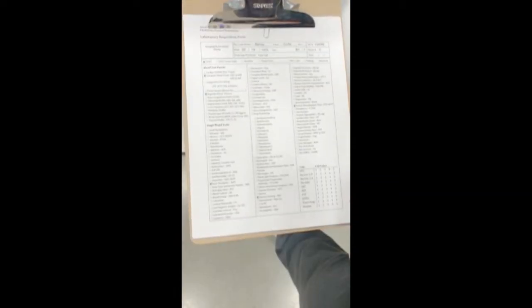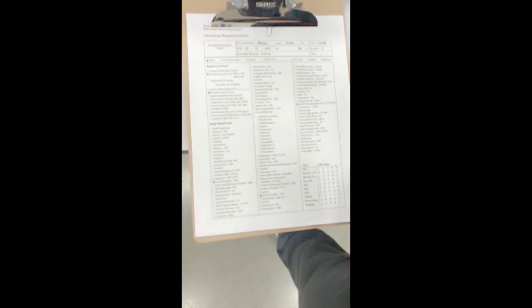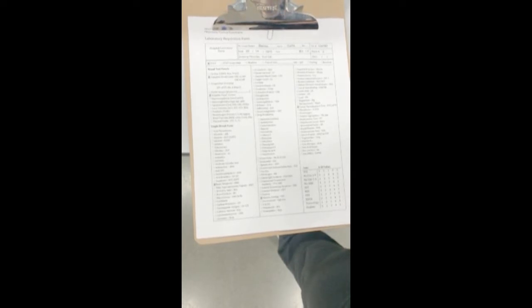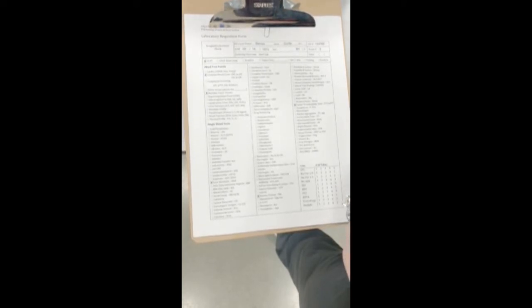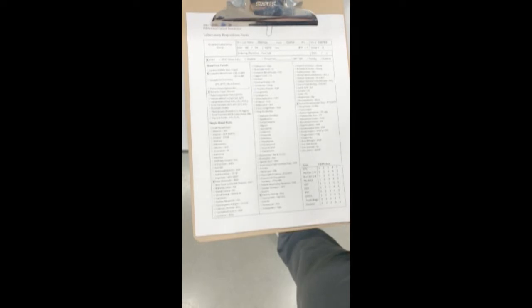Now we're going to be taking a look at the requisition. We can see we have a stat order checked off in the top left here. Most of these tests are chemistry — we have a serum hepatic panel, a basic metabolic panel, and a glucose. We also have a CBC for hematology and a PTT for our coagulation department. We're going to want to draw our rapid separator tube — that would be our orange thrombin tube. With the basic metabolic panel, you can either grab a light green, or just put that in the same orange thrombin tube as the serum hepatic panel.